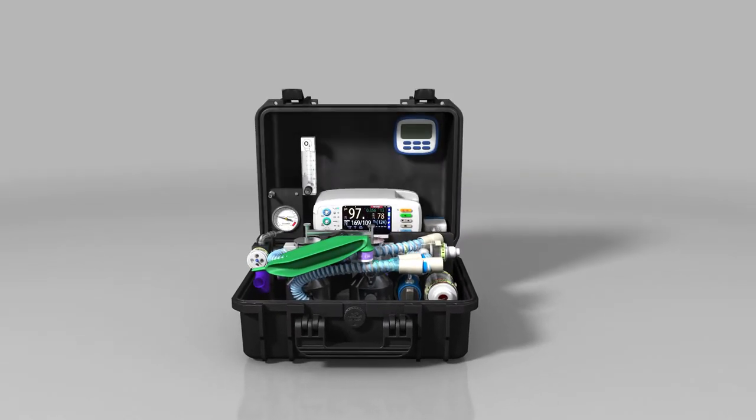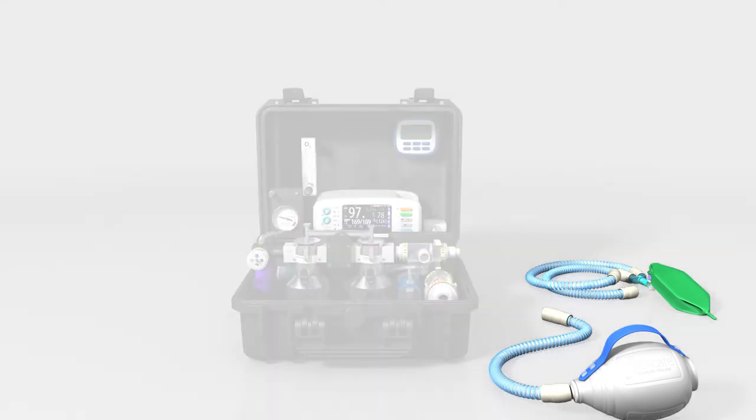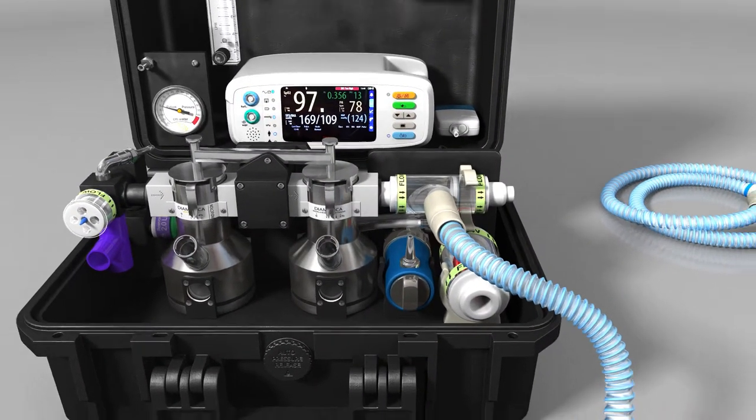Open the case and remove the patient circuit. The DPA Duo is ready assembled with only the patient circuit and PEEP valve required to be connected. Connect the self-inflating bag to the front of the inspiratory valve via a silicon tube.